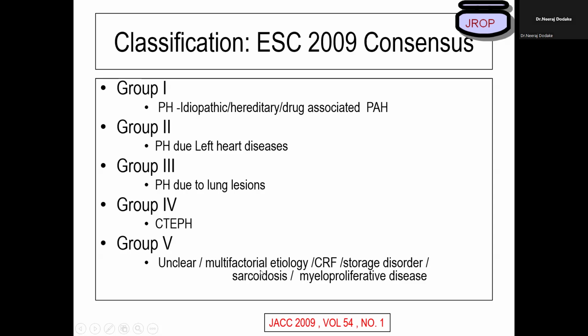So whenever we talk of pulmonary artery hypertension, by echocardiography we try to label whether this patient belongs to post-capillary, that is group 2, pre-capillary, that is group 3, or a mix of these two. And we try to label why this person has pulmonary artery hypertension.